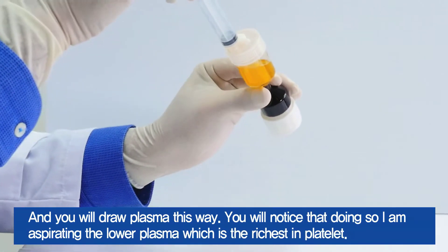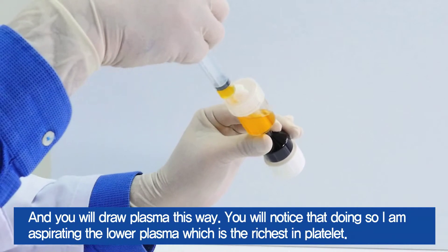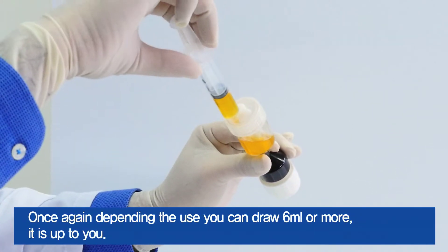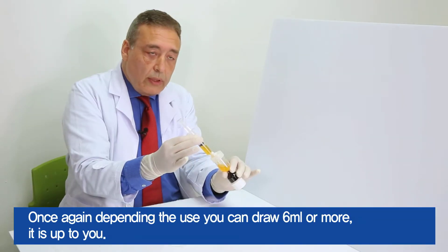You will notice that doing so, I'm aspirating the lower plasma, which is the richest in platelets. Once again, depending on the use, you can draw 6 ml or more. It's up to you.